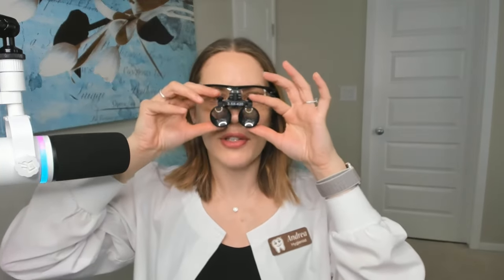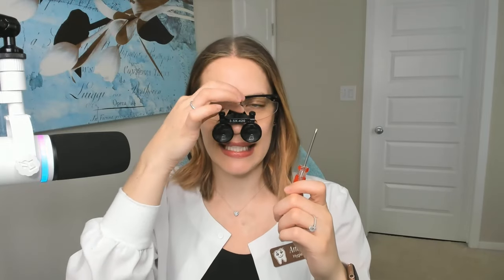You can adjust them this way. Can you see how they're getting wider? And then they're coming in. So the way you adjust them is going to depend on how you sit when you're seeing clients and just what works better for you. I find the closer together for me, the better. So that works for me. And I love how you can adjust them this way too. This is where the screwdriver comes in, okay? Because you're going to need to tighten these areas every so often if you find you are constantly adjusting them.